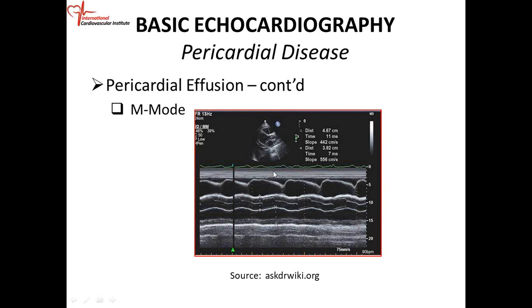So the first thing you encounter is the chest wall. Okay, the pericardium. This is the parietal pericardium right up here. Okay, this is your pericardial fluid. So the darkened area is the pericardial fluid, and just below that you'd have the serous pericardium, and then the RV wall. So you know the RV wall has indentation periodically. Then this is the RV cavity, right there.